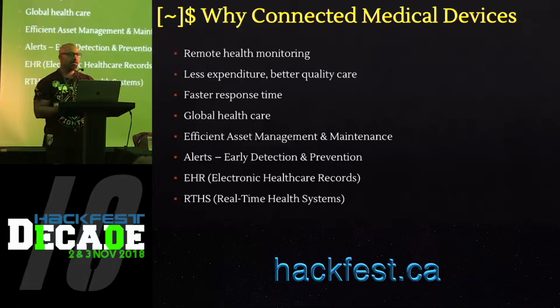Because I'm a wannabe reverse engineer, I thought this is my chance to start doing some reverse engineering. So I loaded up a system-level debugger on the operating system and started reverse engineering the logic of the particular application. I was doing both static and dynamic reverse engineering. On the left side is the piece of assembly which is responsible for loading the file in memory and decrypting the content.